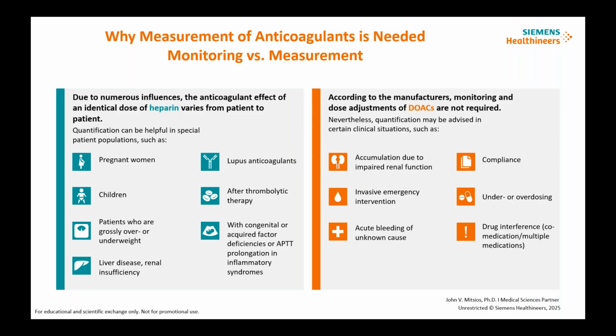Now, when we think of DOACs, according to the manufacturers, monitoring wasn't really needed to adjust any dose, right, because that was one of the quote unquote selling points of these newer oral anticoagulants. You don't need routine monitoring. But sometimes quantification of a concentration may be necessary to facilitate additional clinical management strategies, for example, administration of an antidote. And there are specific clinical situations that may warrant this measurement of a DOAC.